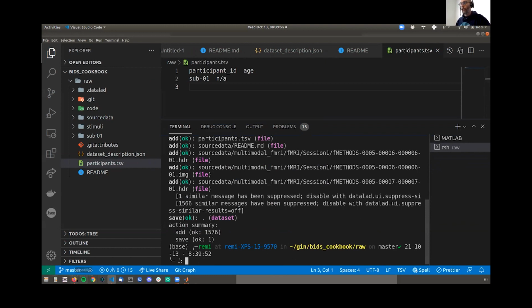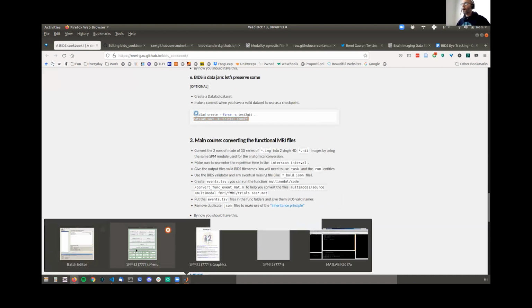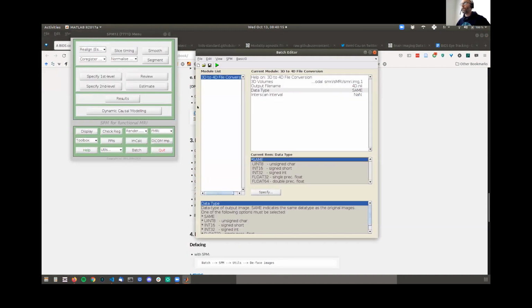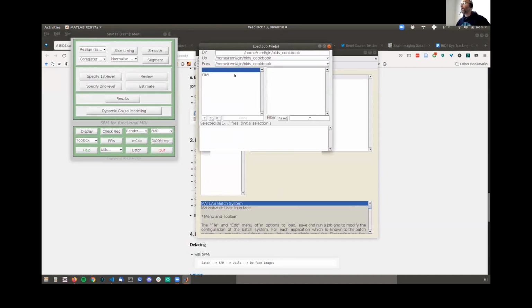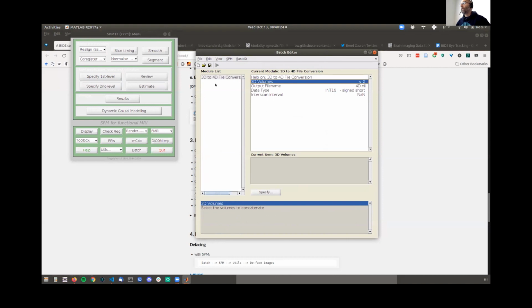Then the next step is converting the functional MRI data. It's going to be very much the same, so I'm going to do it a bit more rapidly here. We want to grab our functional data and convert it to a 4D format.